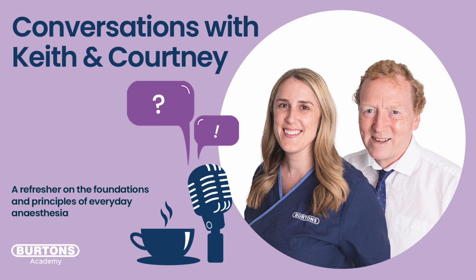So we can go up to the machine, whatever it is, and set the tidal volume. Bang, there you are. 155 mils, 160 mils for our patient. And we know when we start ventilating, we're going to want that to get to about 10 centimeters of pressure. So we'll look to see what the pressure is when we start ventilating. We've got some other choices to make.